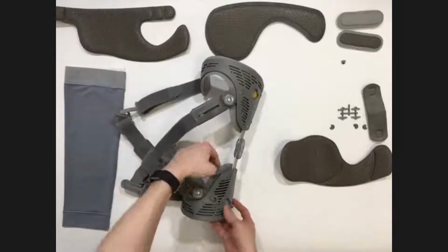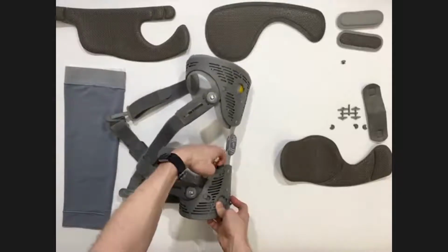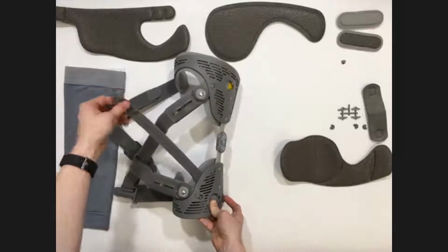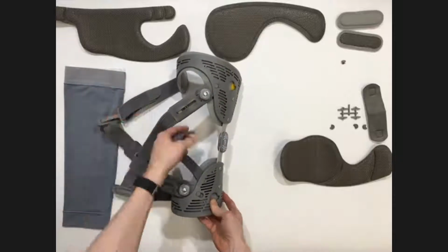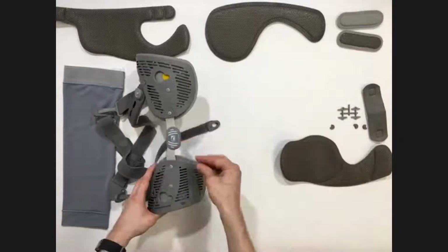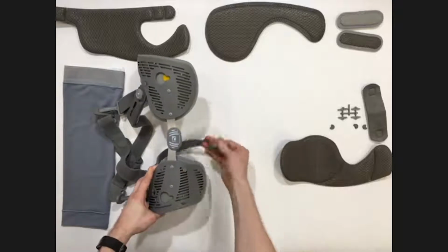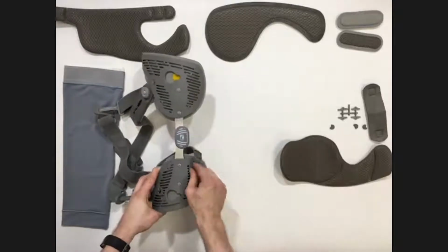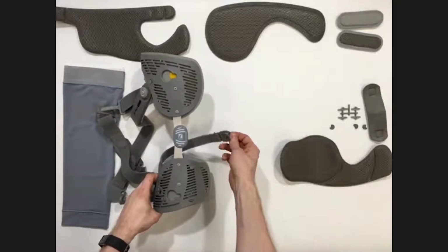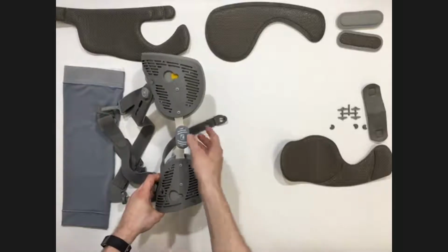So we place that in, and we can use any of these vents either side of the frame. Place that through, twist fit, and it will just attach into position. This will then come round to the other side, and then we have this small button which connects in, and again you can choose where you would like this. This brings round and then clips into position. The patient has a finger loop in order to attach this. So this is size adjustable. We've already trimmed this one to fit in this case.